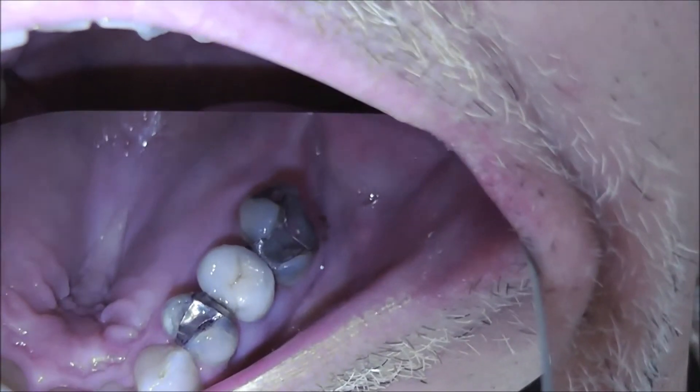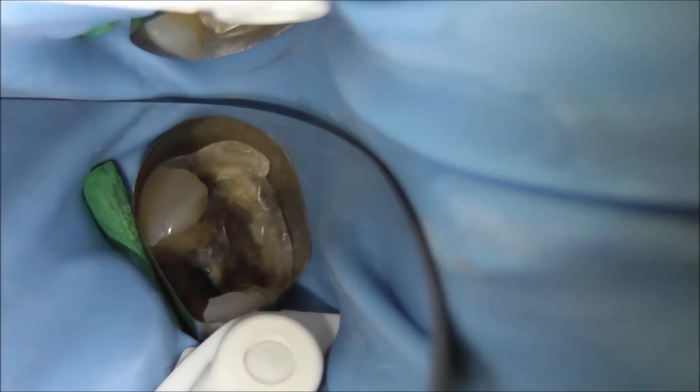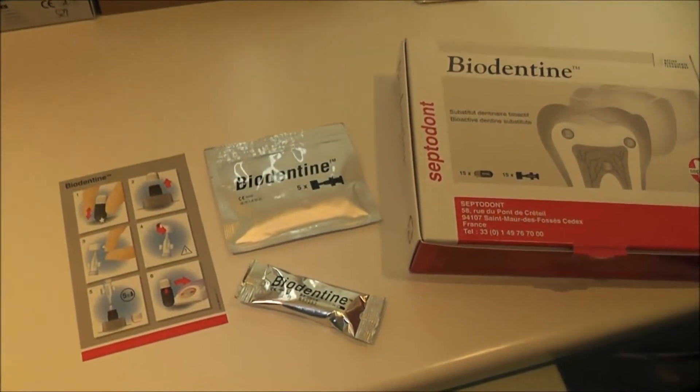We are going to look at this case where there is a cracked amalgam and the tooth is given occasional dull ache. It is vital to cold, so we remove the amalgam and expose some very deep caries, but there is no exposure of the pulp, so we decide to do an indirect pulp cap with biodentine.